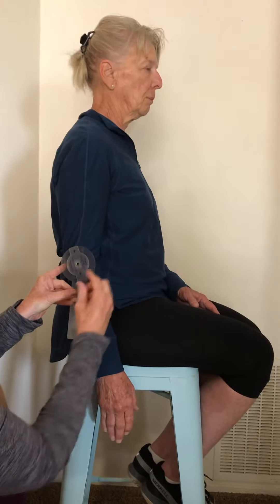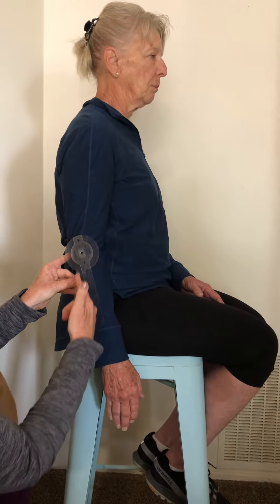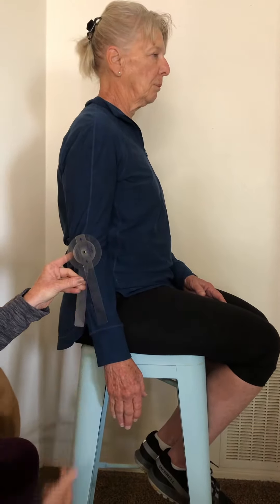We're going to measure elbow flexion and elbow extension in a seated position. I already know from observation of her movement that she has normal, within a normal range of elbow flexion and extension. We're going to use our goniometer and measure.